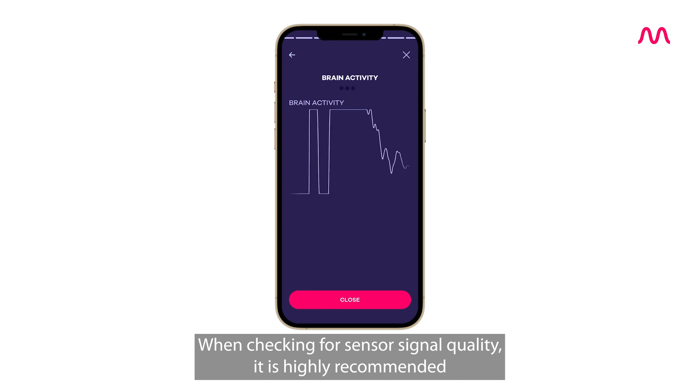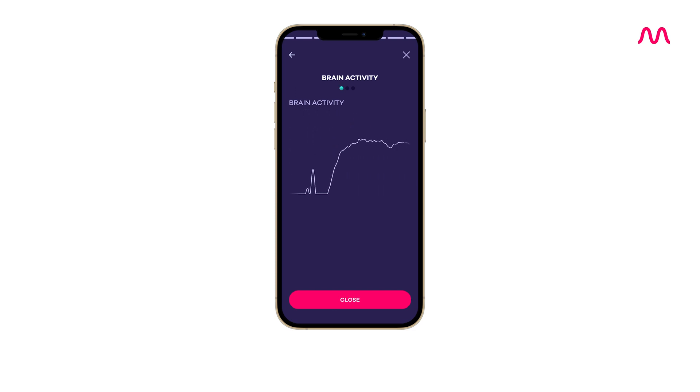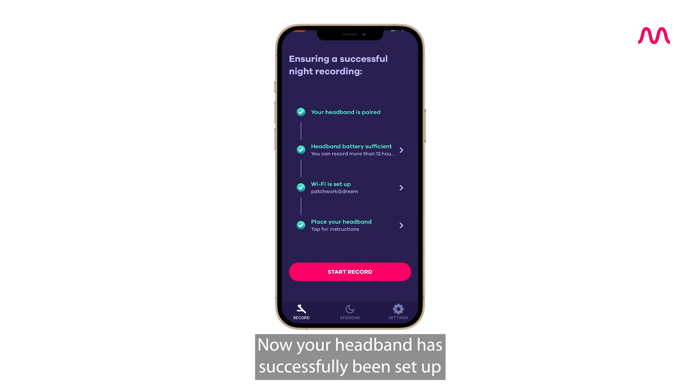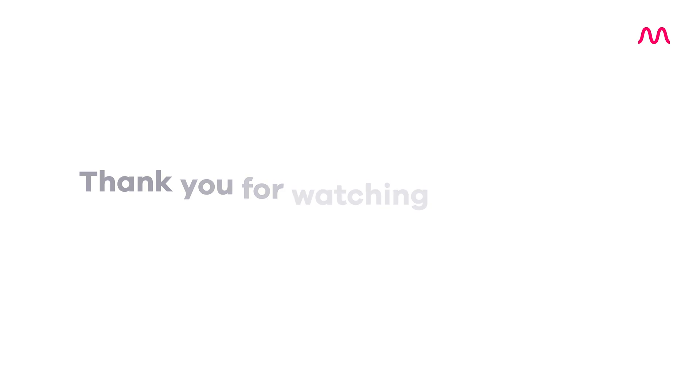When checking for sensor signal quality, it is highly recommended that you are in a lying position. Now your headband has successfully been set up and this only needs to be done once.